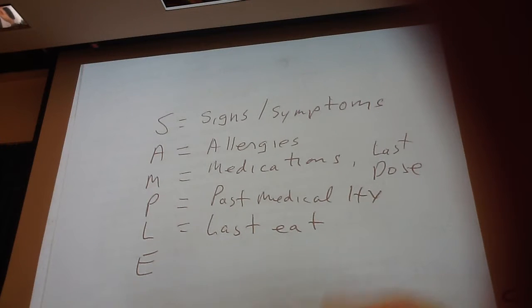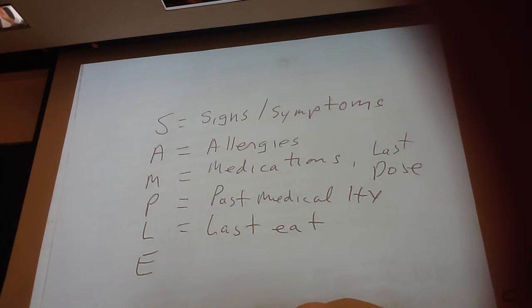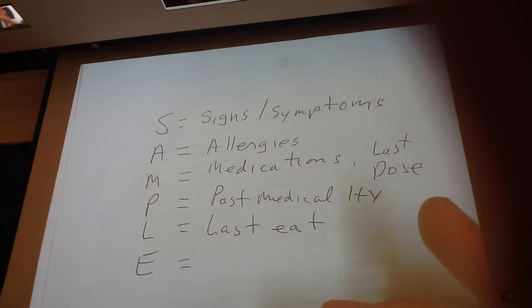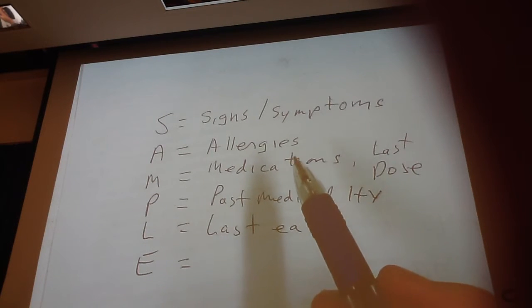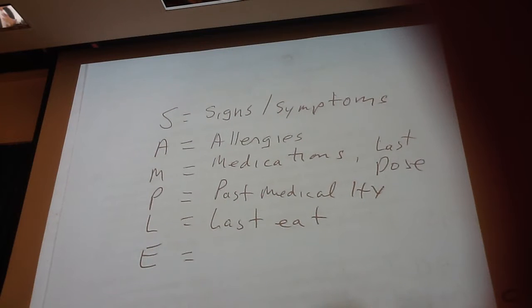Yeah, if you're doing a thallium study and the patient has eaten something, where is your radiopharmaceutical going to go? Stomach. Okay, yeah, or to the GI tract. Remember that thallium will follow the distribution of muscular activity. In fact, we used to even use it to evaluate perfusion of the leg muscles on patients that had claudication. Don't do it too much. I don't think they do it at all anymore. But anytime you need to evaluate muscle activity, that's a good test.